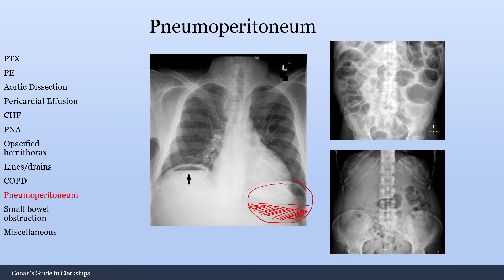This is another sign right here. This is an abdominal x-ray, and this is called Rigler's sign, which is also a sign of pneumoperitoneum. You can see this increased contrast of the bowel wall. This is a normal abdominal x-ray down here. The reason you have this increased contrast is because you have air improving the contrast, so you get this more brightly lit up bowel wall here.